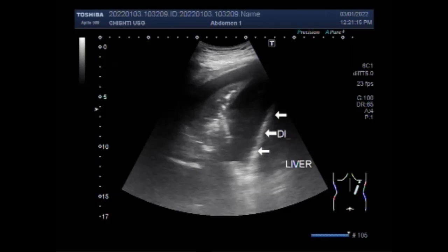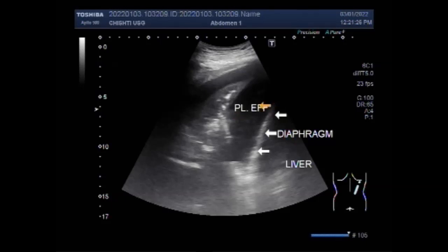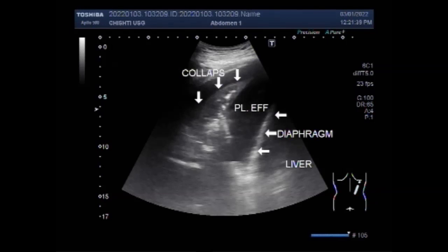This is the diaphragm. Now this is the pleural effusion — the pleural fluid — and this is the collapsed lung tissue. You can see the lung tissue is collapsed and it is floating in the pleural fluid. This is the collapsed lung tissue.